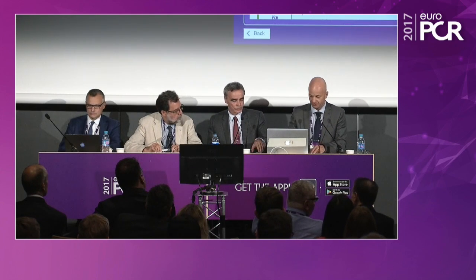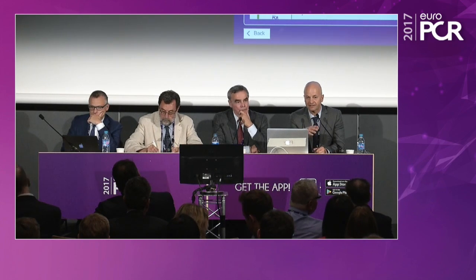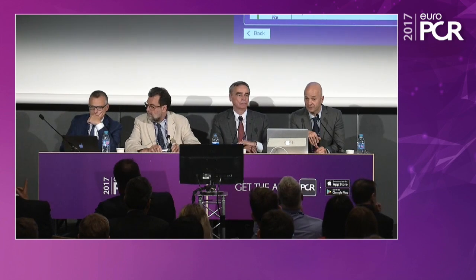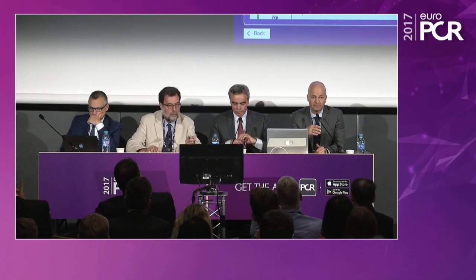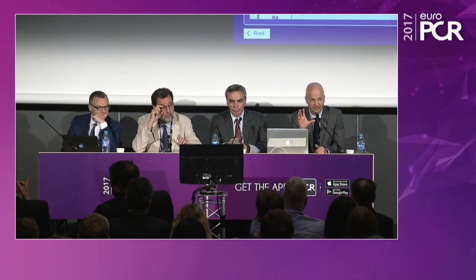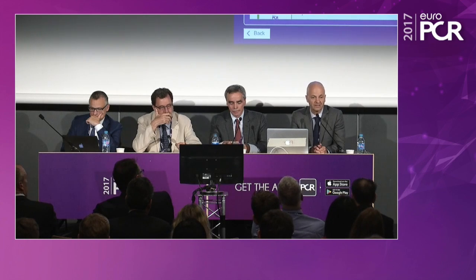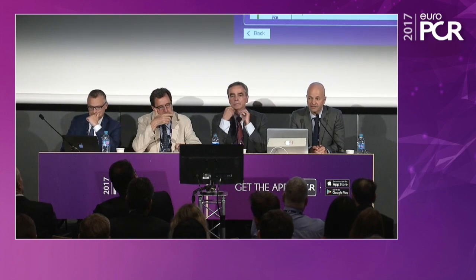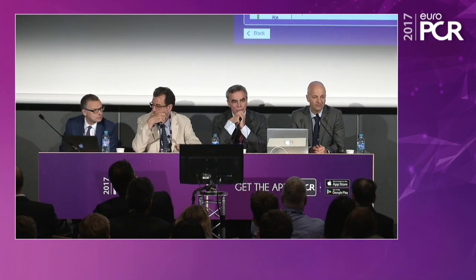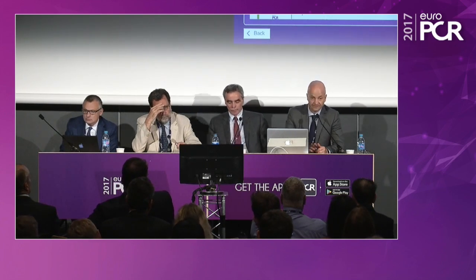Yeah, thank you very much. I'm going to stay here because the movie is on the computer. Tricuspid regurgitation is very frequent, and it also drives mortality, as we know, in patients with heart failure or with concomitant MR. And most of the patients are not treated; probably everybody of you has this picture in mind. In the United States, there are 1.6 million patients with clinically relevant tricuspid regurgitation and only 5,500 surgical cases per year. So there is a tremendous unmet need for this type of patient and the need for a catheter-based approach.